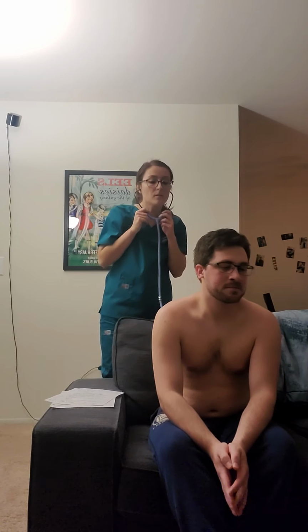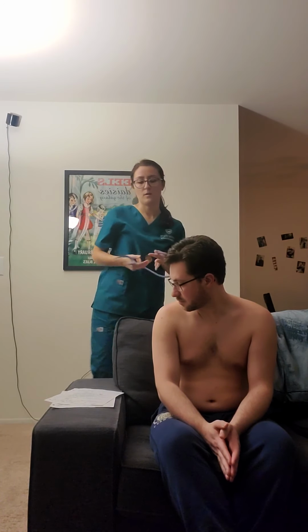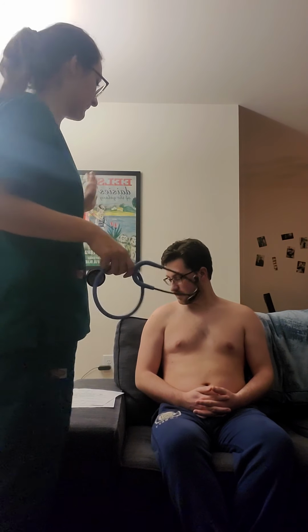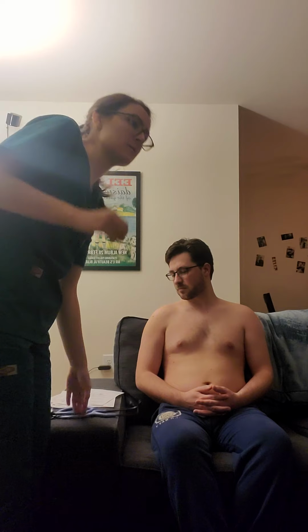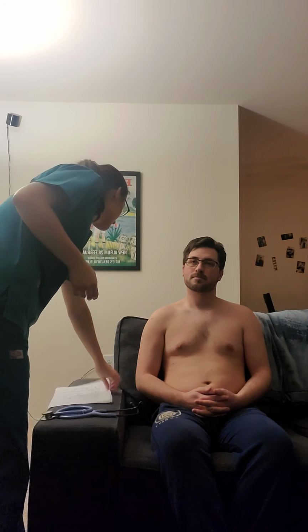Okay, and then when I auscultate the posterior lung fields, make sure that I always stay away from the scapula, so I'm not going over any bone. And when I am auscultating the middle part of the back, make sure that I stay in between the shoulder blades and the spine. So next I am going to go ahead and demonstrate egophony.